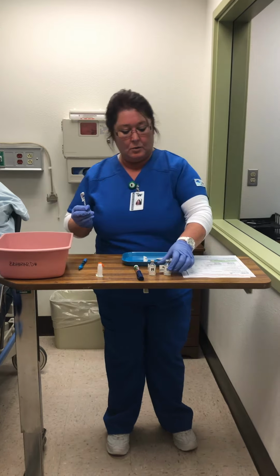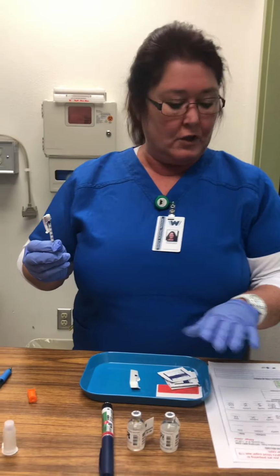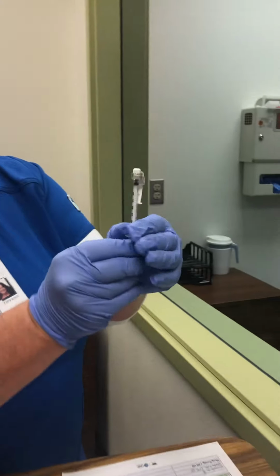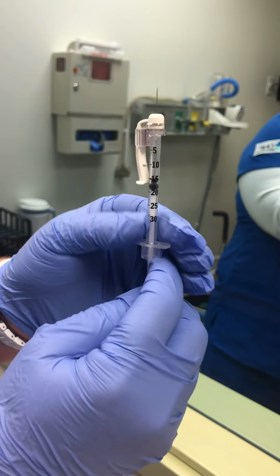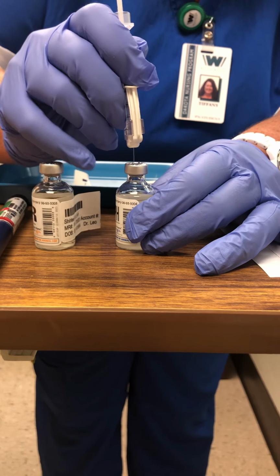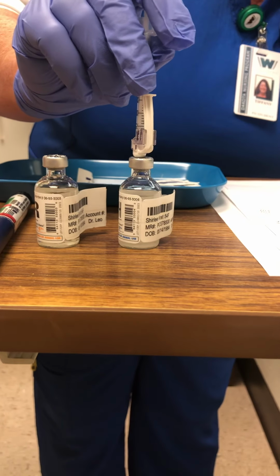And we are going to put air into the NPH first. And because I need 15 units, I am going to draw 15 units of air. And I am going to stick that right in the bottle, not touching the liquid. Can you see that? Mm-hmm.